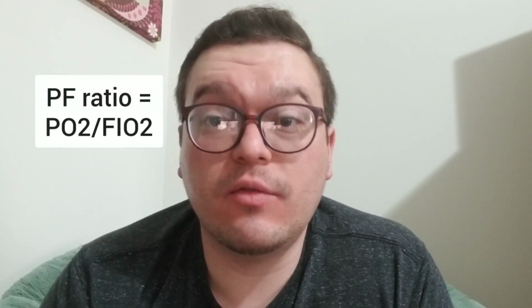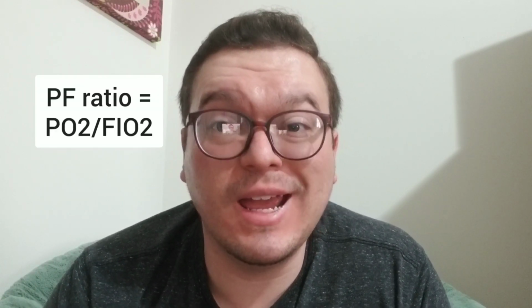One quick tidbit that I can give you is that if you want to get an idea of where a patient should be with a set FiO2, you can multiply their percent FiO2 by 5. What do I mean? If you give somebody 40% FiO2, multiplied by 5 would be 200. You would expect on their ABG to get a PO2 of at least 200. If it is less, then obviously the patient has a low PF ratio and the patient has an AA gradient.